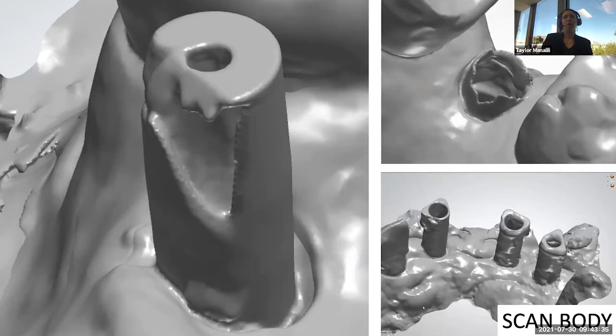Okay, so again, I've seen it on some of the scans that we do. It looks great in the first scan that I take, and then I walk out of the room while it's post-processing, and for whatever reason, the scans didn't merge properly, and the post-processing scan looks something like this. So it's really important that you go back in after it post-processes and reevaluate the scans in this phase. Because if for some reason something didn't merge correctly, you don't want to send this to the lab.